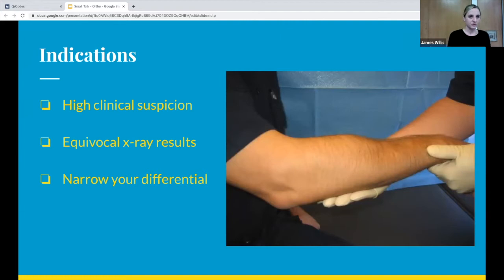And then MRI is also another method, but as we are very well aware, MRIs are really, really hard to get in the emergency room. They're expensive. And in the case of pediatric populations, we usually have to OBS them because it takes so long to get it. So ultrasound is really useful to give you a lot of information really quickly. It's safe, there's no radiation, and it's pretty easy to do. It also allows you to examine the area of interest in many different planes, whereas an X-ray is just a static image. It depends on the view, especially the quality of the X-ray produced by the technician as well.